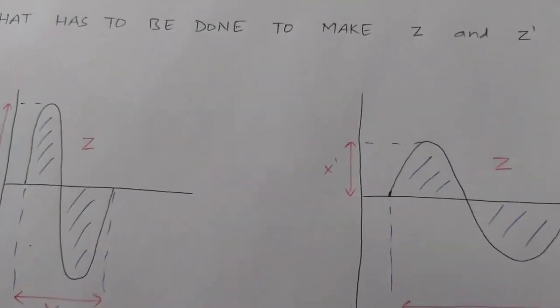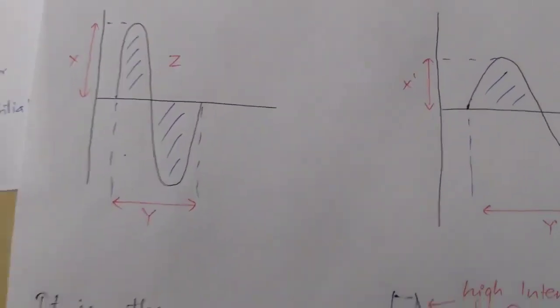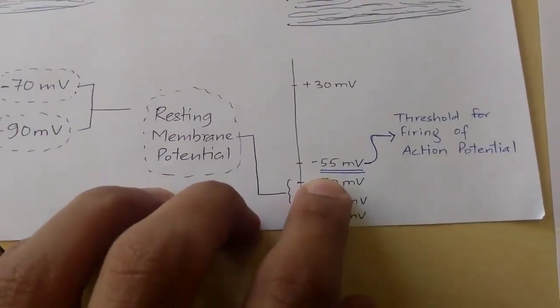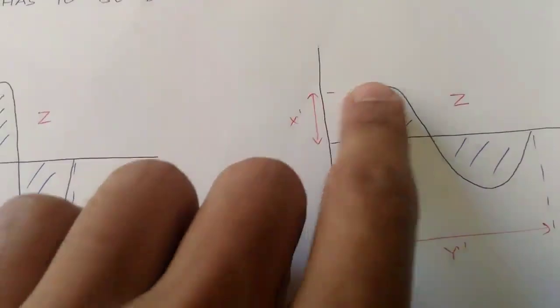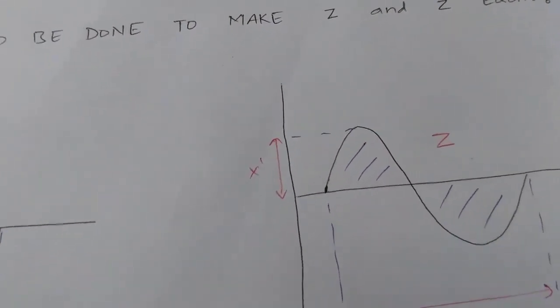In case of nerve or in case of muscle? In case of nerve, we require lesser intensity because the gap or the journey is smaller. In case of muscle stimulation, which we require in denervated muscle, the journey is long. We require more area under the curve or more amount of charge to get transferred.